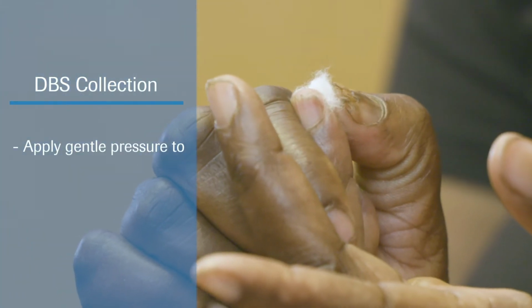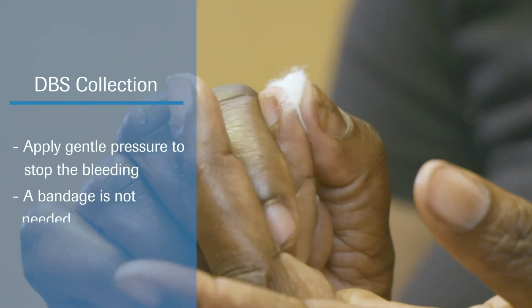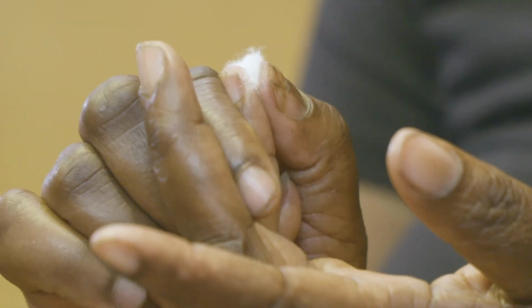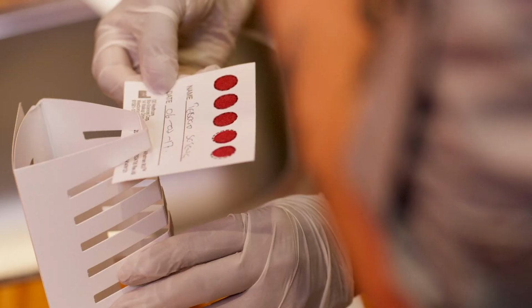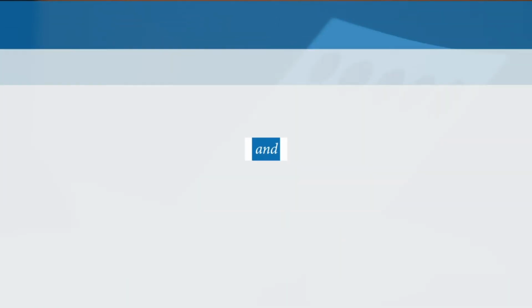When completed, elevate and use clean gauze and gentle pressure on the puncture site to stop the bleeding. Check the puncture site to make sure the bleeding has stopped before the patient leaves. Here are examples of correctly collected DBS samples with all 5 circles properly filled.